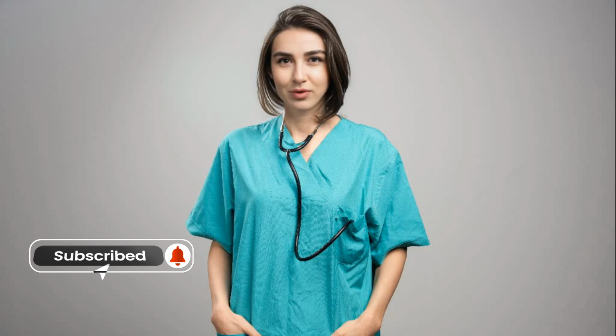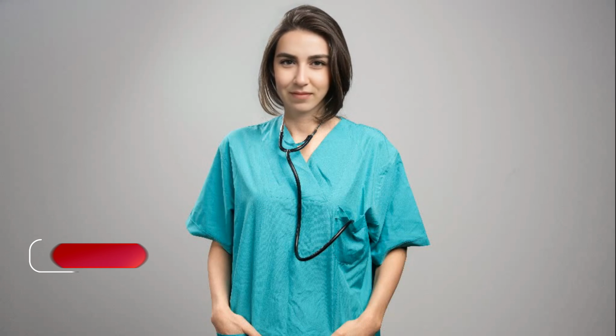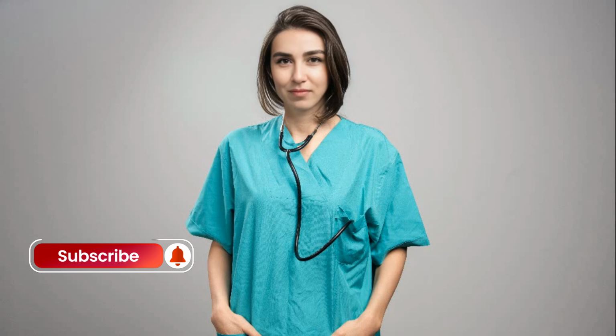5. Chronic total occlusion, CTO. In cases where an artery is completely blocked for a long period, chronic total occlusion, angioplasty is more challenging. These blockages may require specialized techniques or might be better suited to coronary artery bypass surgery, CABG. Alternative approaches if angioplasty isn't fully successful. If angioplasty does not successfully open a blockage or if restenosis occurs, doctors may consider other options.